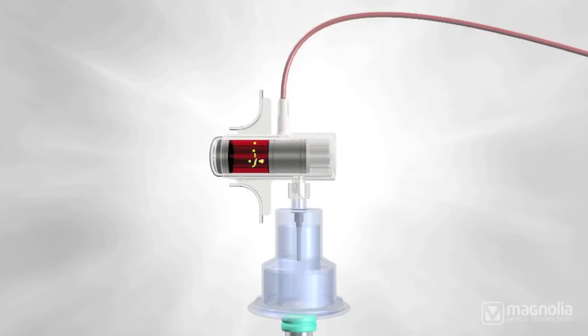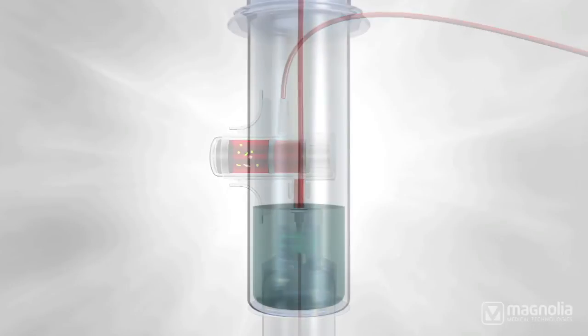Finally, once Steropath has been fully actuated, a second sterile blood flow path is accessed that allows venous blood without skin contaminants to flow into the culture bottles.